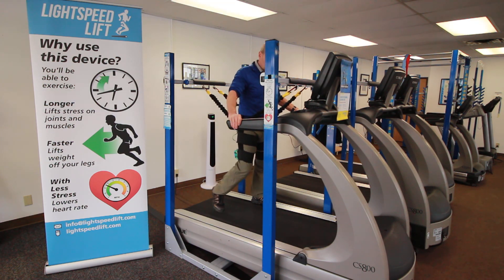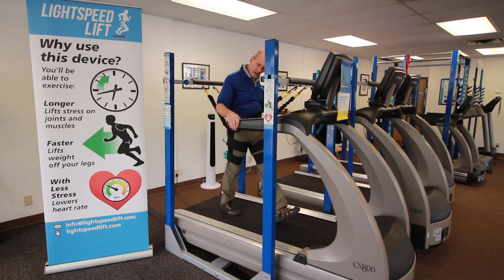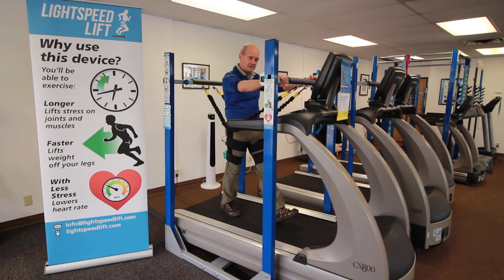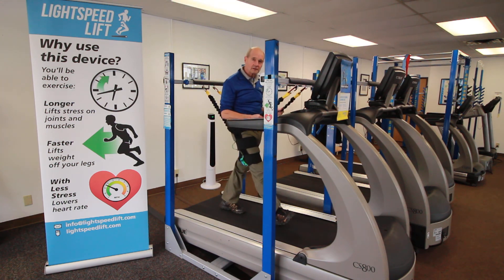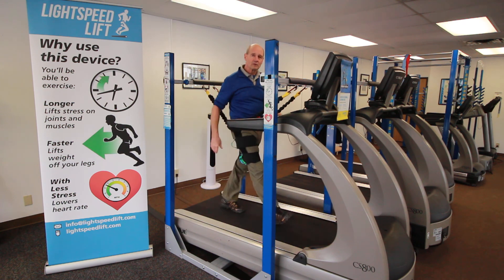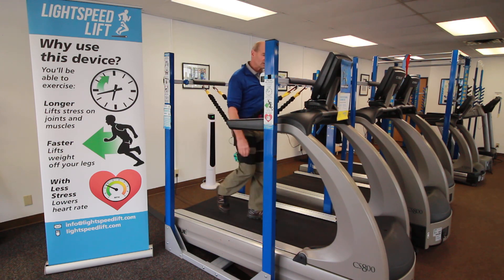Get that client comfortable. First off, walking. You have access to hand holds — you can hold down the front, you can hold here. Ultimately what we like to see is people being able to move the arms in a normal walking motion.